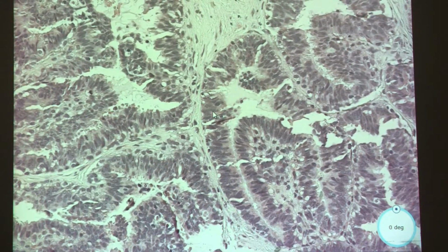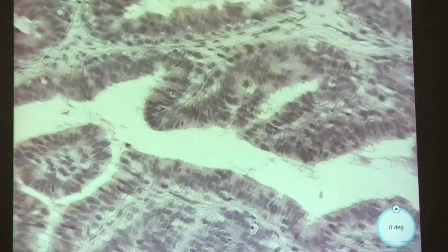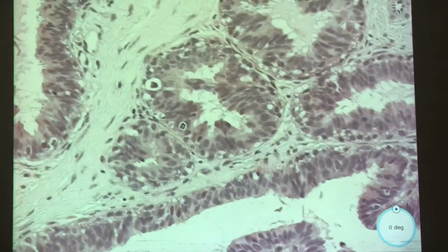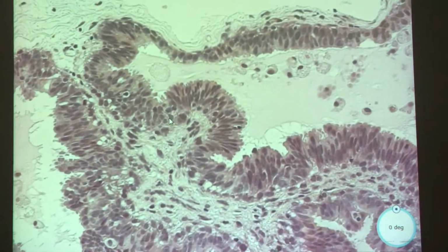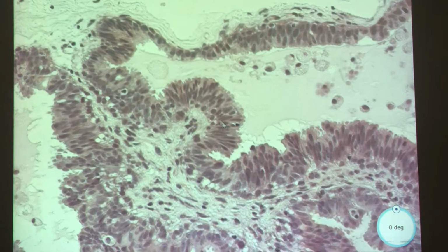Uh-oh. Maybe. Okay. I don't know. So in breast, do we want things to look the same or different? Well, judging from that leading question, I would say different. Right. The way I always looked at breast, as a first year, was breast looks terrifying, kind of like fallopian tube. It's terrifying on high power, and you're like, wait, that's normal.